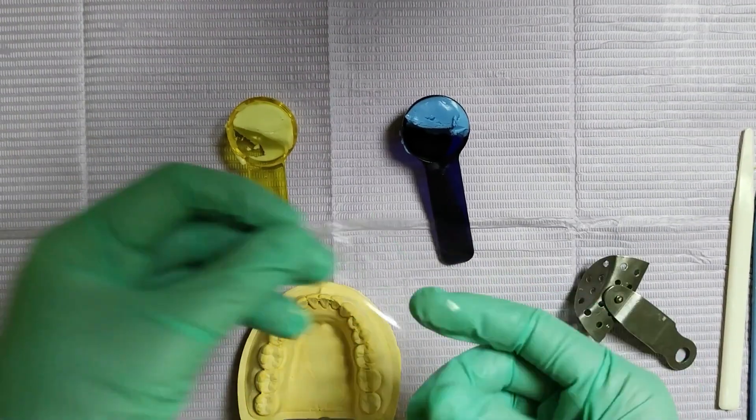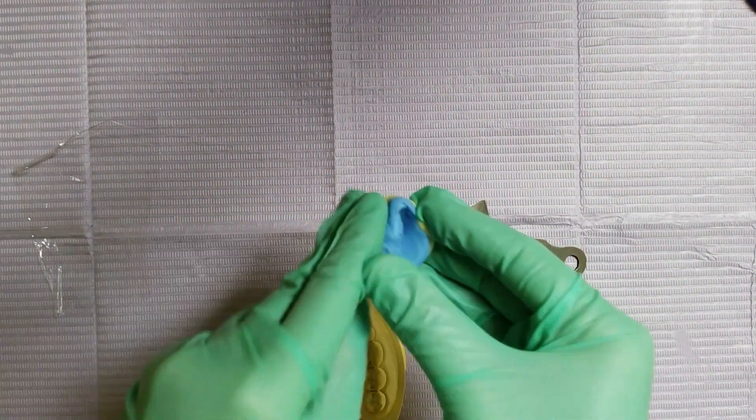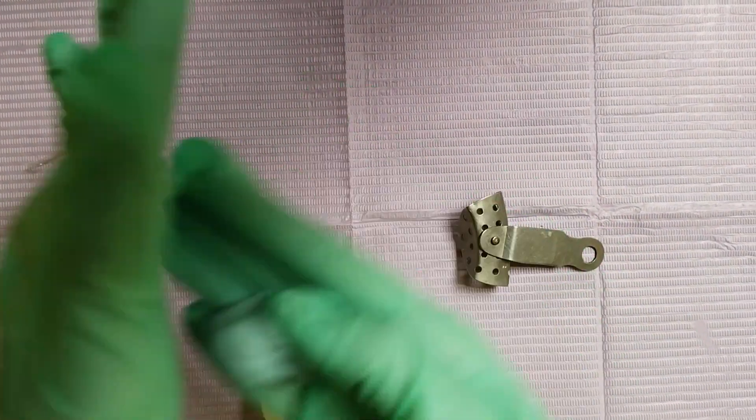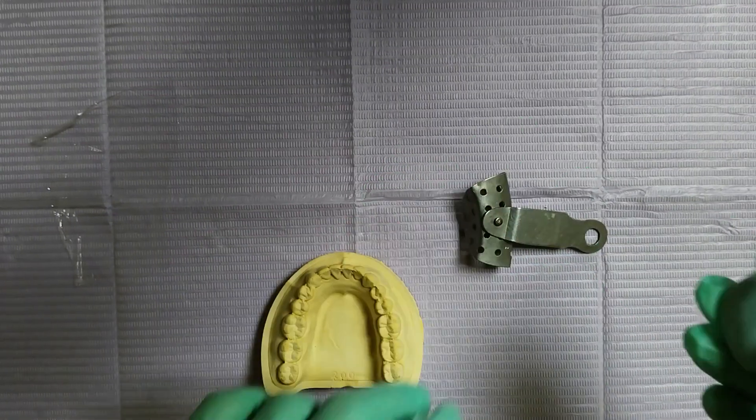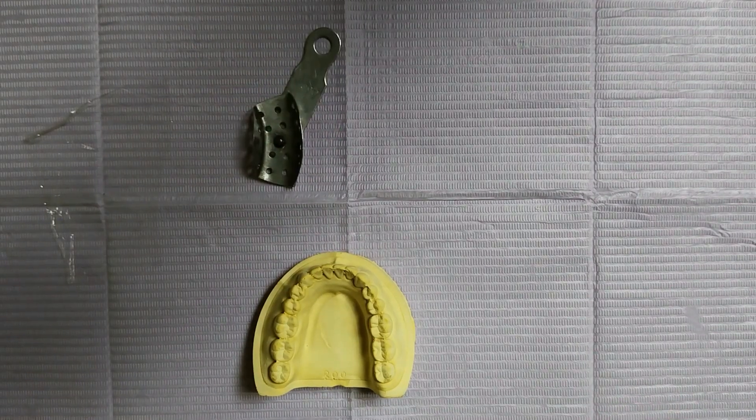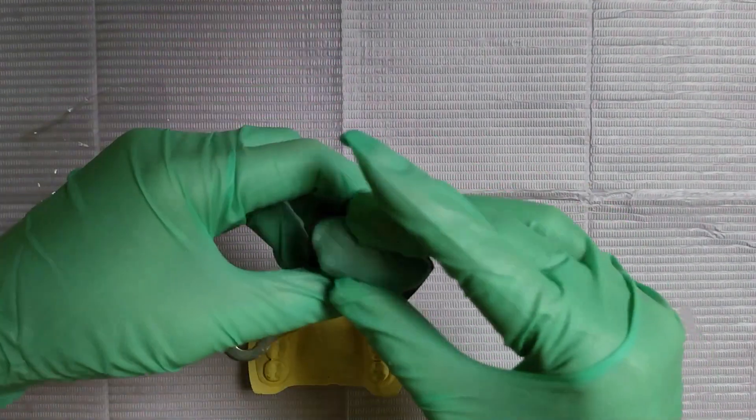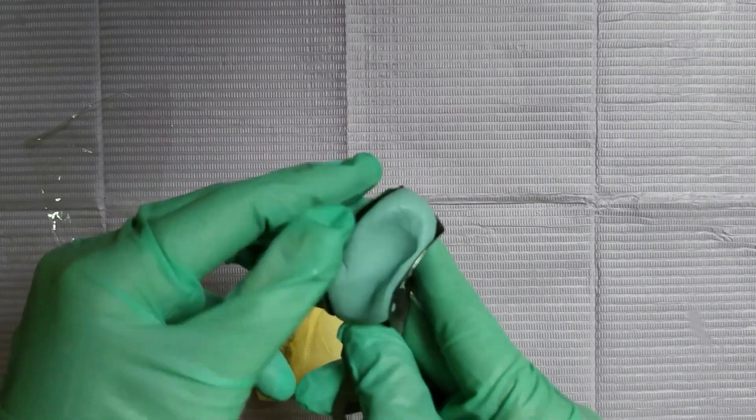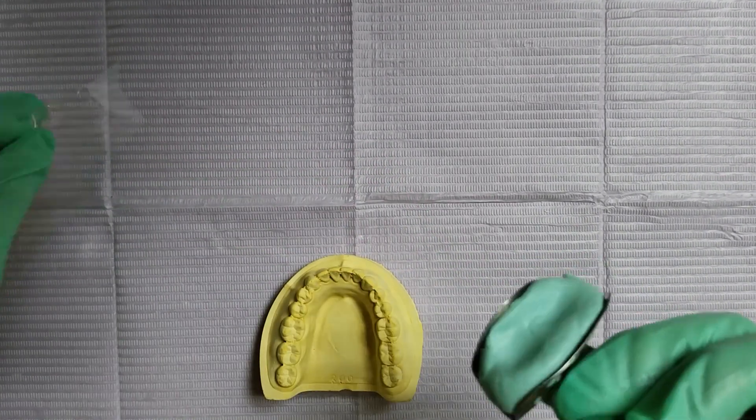Mix the putty until you get a homogeneous mixture with no streaks. You have about 30 seconds to do this. Then make a roll and place it on the tray. Make indentations for the teeth and place your spacer on it.